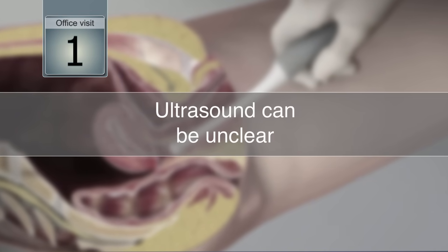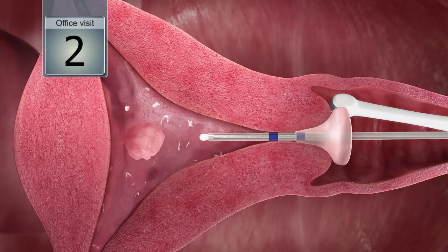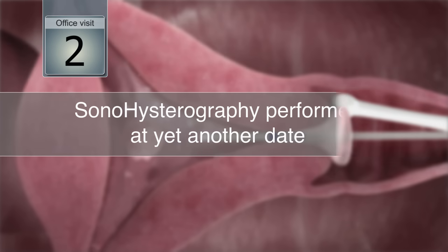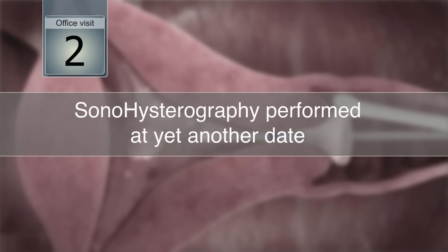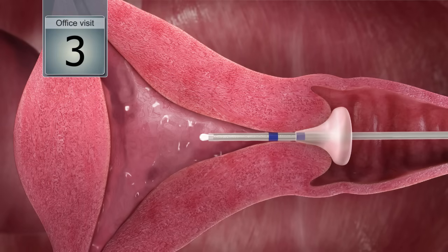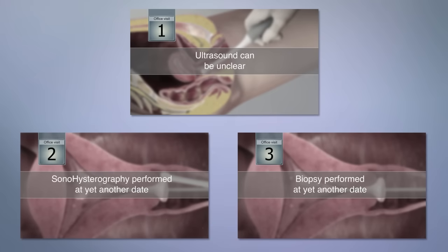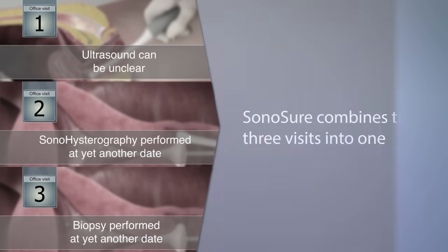When abnormal uterine bleeding is present, the typical first step towards diagnosis is an ultrasound. When the results are unclear or if a lesion is present, a separate procedure or saline infusion sonohysterography must be performed at a later date. Finally, if diagnostics show an abnormality, a biopsy must be performed at yet another office visit or via secondary uterine access.